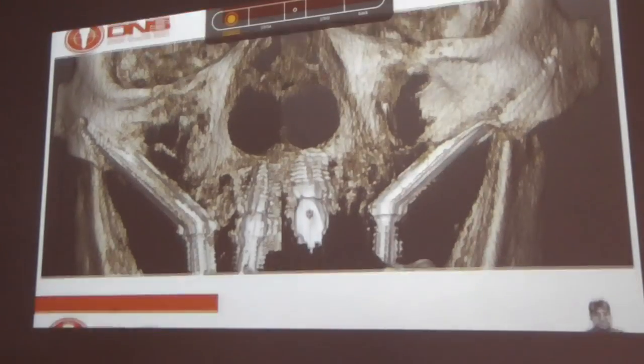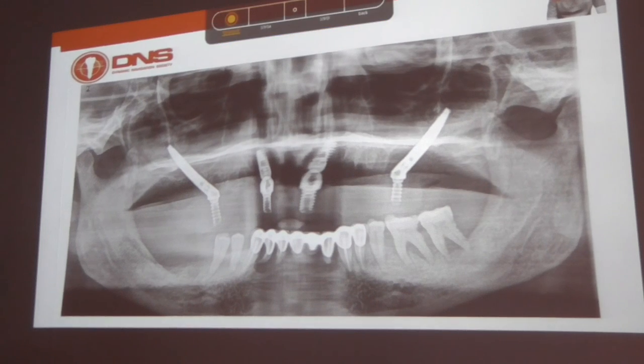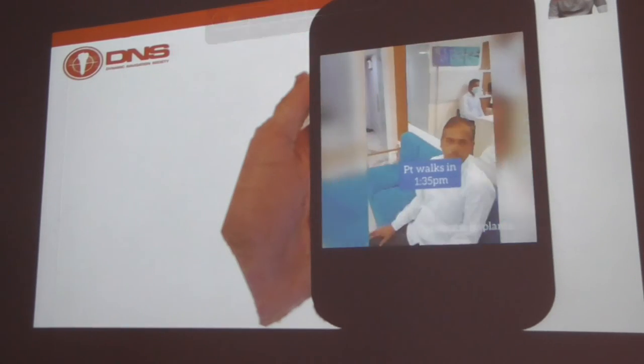And which number do you get in the planning? Two. Two. Not one, two. One, two. No, with zygoma, to get one, you have to put one on the buttress, which doesn't make sense. So two. Yes.